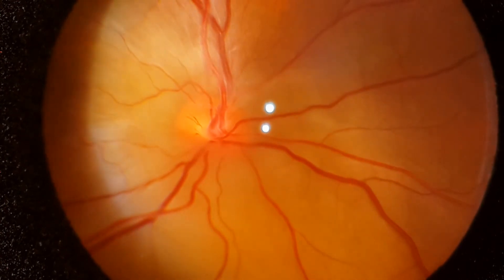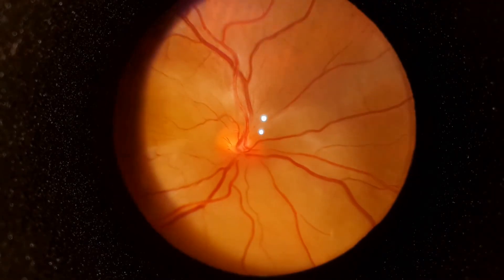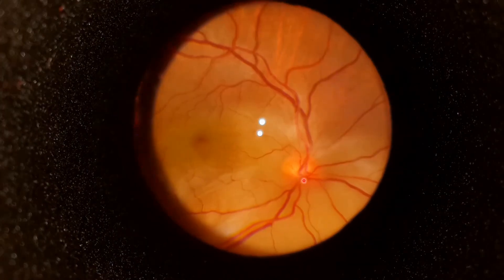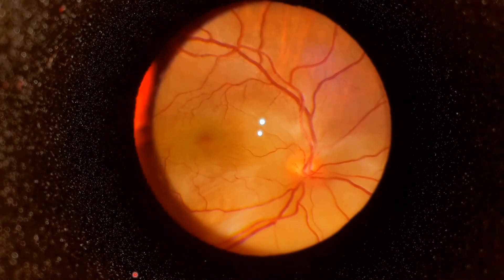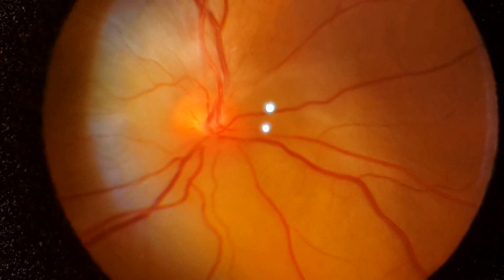This is a patient who presented with exudative retinal detachment. Note the venous pulsations. This patient has secondaries with exudative RD, with a mass compressing the inferior part of the optic nerve.